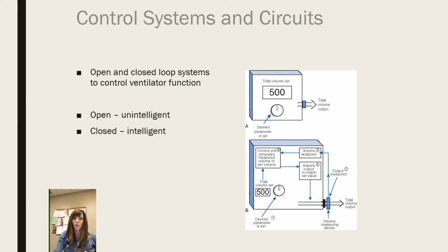So as far as the ventilators that you've used, the IPPB would be an open loop ventilator. The information goes out, you set the pressure, you set the sensitivity, you set the FiO2 with air mixture or not, and then you set the patient up, and whatever the patient gets, you don't exactly know what their tidal volume is. If there was a leak in the tubing, unless you heard it, you wouldn't know. You don't get the return values. But the closed loop ventilators will tell you what air came back from the patient, what their true PEEP is, what their true pressures are, what their static compliance is, what their Raw is, that kind of thing. That's closed loop, meaning the information that goes out comes right back in.